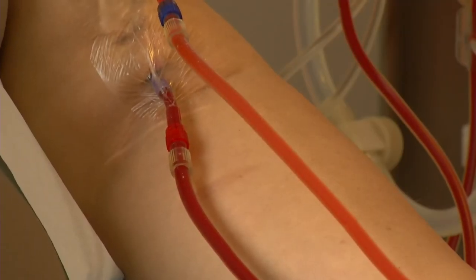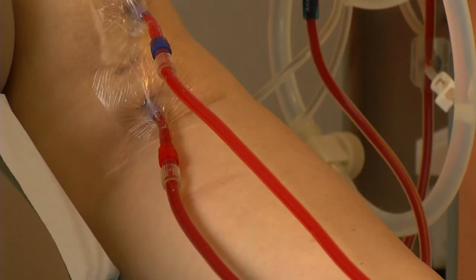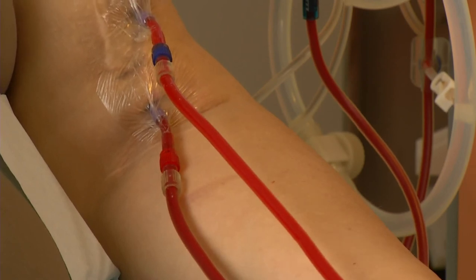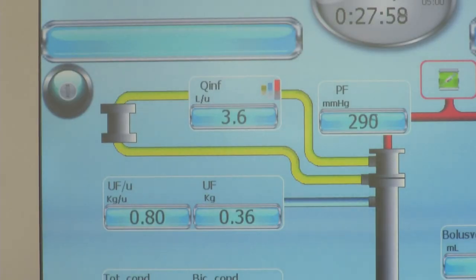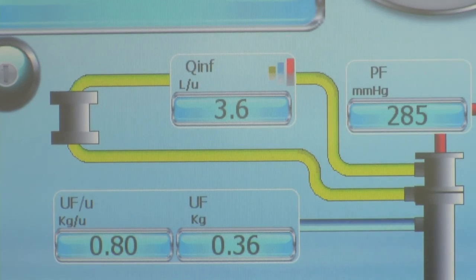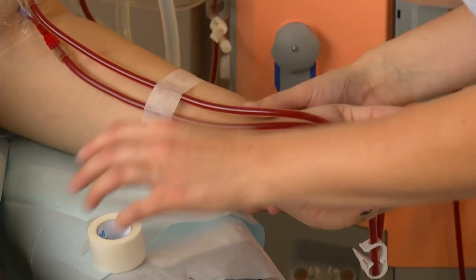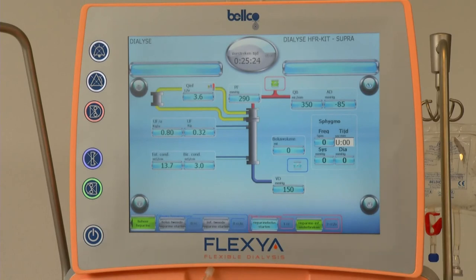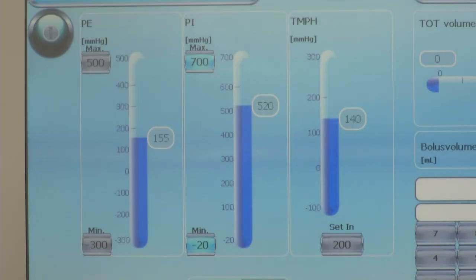We enter the duration time of the treatment, the ultrafiltration volume, the anticoagulation, and the sodium and bicarbonate settings. The infusion pump that extracts the ultrafiltrate of the convective part of the dialyzer will progressively accelerate automatically up to 3.6 liters per hour. You also have the possibility to manually set the speed of the infusion pump if necessary. During the treatment, we monitor the infusion, the arterial, the pre-filter, and the venous pressure. Careful monitoring of the patient, the dialysis machine, and the extracorporeal circuit is essential to a successful treatment.